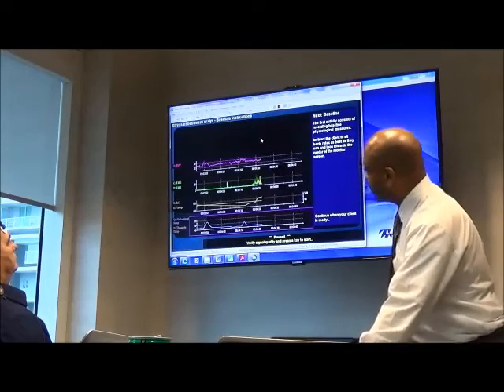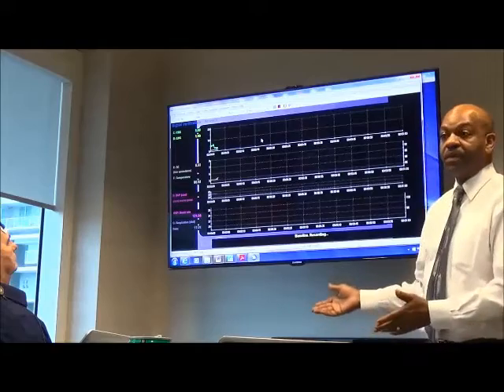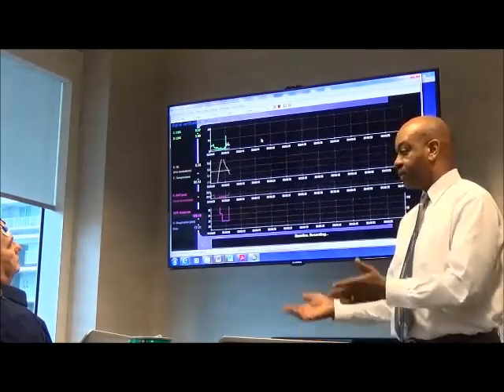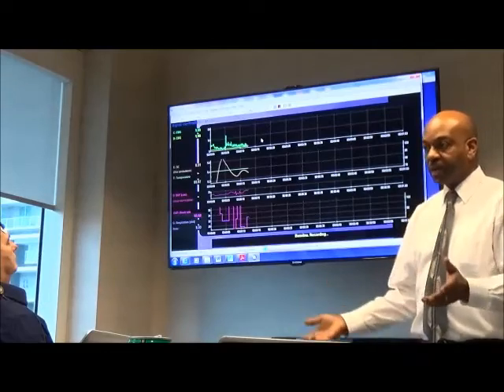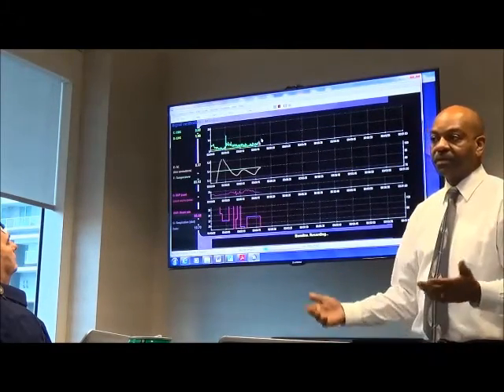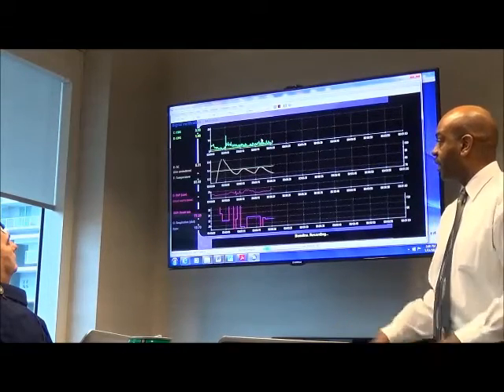So I'll press the space bar. And what I normally would have said, before I press the key, is, okay, now for the next 2 minutes, I just want you to relax. They may ask you, can I close my eyes, or different things, and you can say, okay. And again, I'm not giving any specific relaxation exercise or instructions, just to relax for the next 2 minutes.